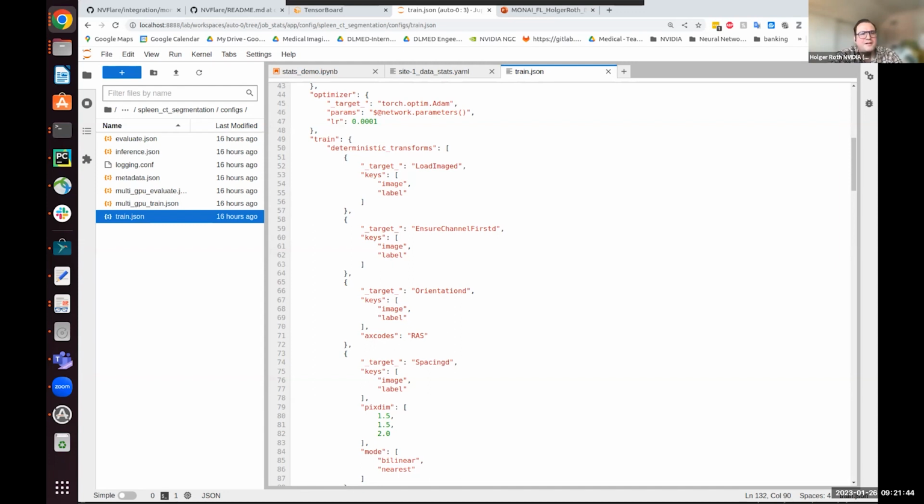But if you manually notice an issue with a client, you can exclude it. As I showed you, this controller workflow gathers the updates from each client. So you could put in a filter there and say, this one I just throw away, or I give it a lower weight, right?